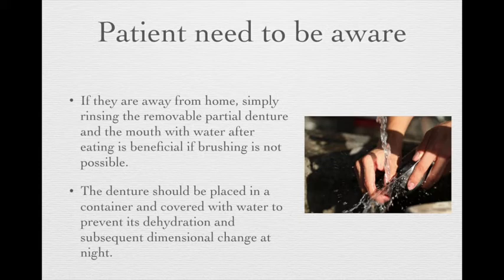When they finish the cleaning before they go to bed, the dentures should be placed into a container and covered with water to prevent dehydration. Because when we leave the RPD out of the water or out of the saliva, that dehydration may cause microfractures in the denture base material, and those microfractures may make the denture base material unsmooth.